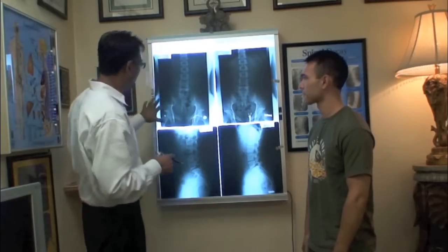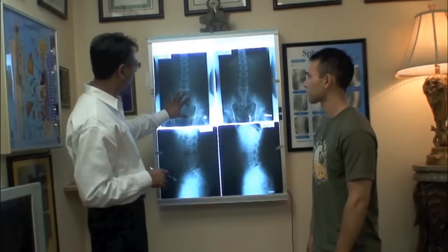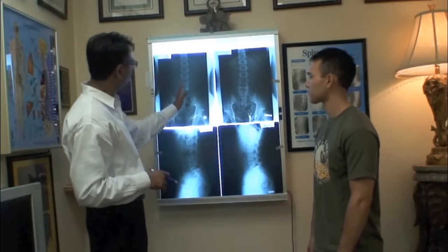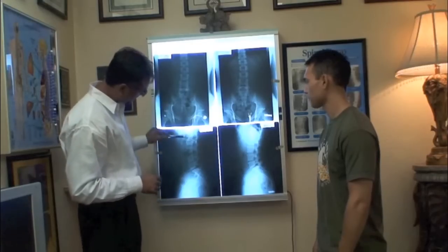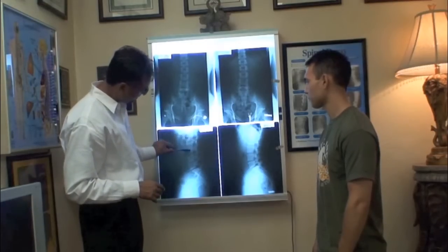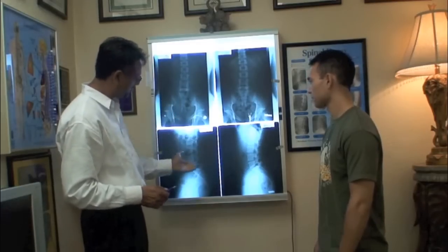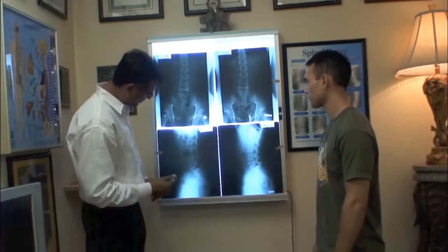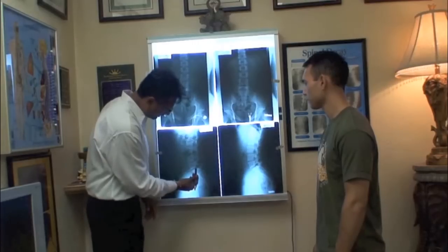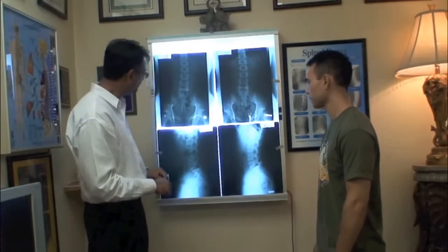So when he first came in, here's the x-rays that we took. Here's the left side, here's the right side on the hip, and we see quite a bit of curvature right through here. On the lateral picture, we're looking at the back of these vertebrae. The curvature should be like a C-shaped curve, and you can see it's a pretty straight curve there. Not only that, but the edge of this bone and the edge of this bone have quite a distance in between, so there's quite a bit of slippage there, okay?